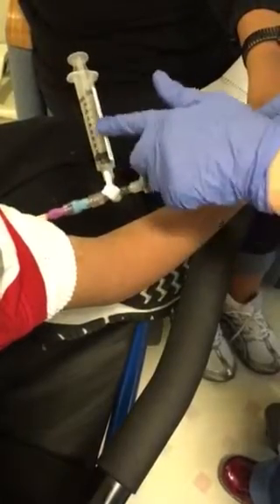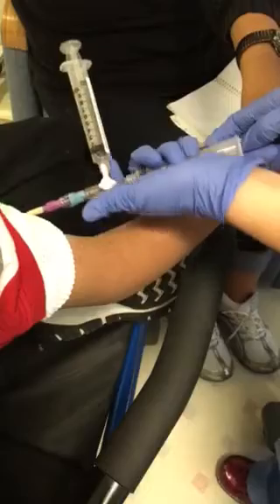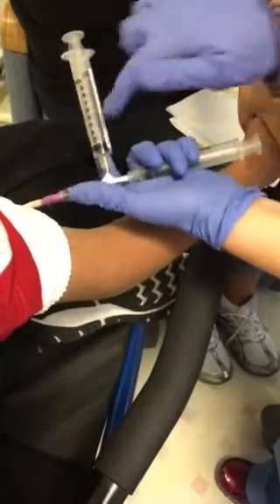Pull back, the lever's going to be towards the syringe with the medicine. Pull back, and it's going to suck in a little bit.